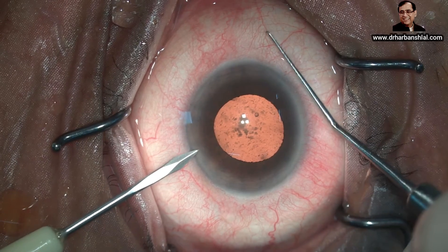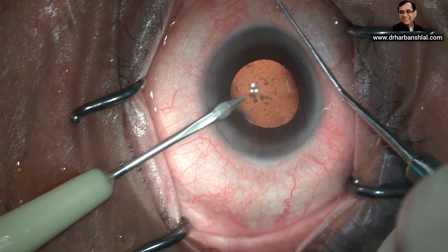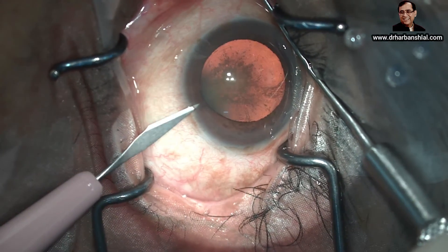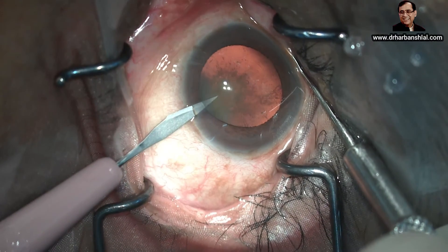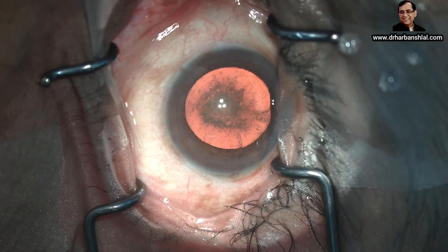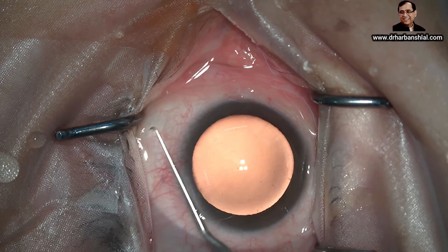We are making it about 0.75 millimeters more central than where we usually make the incision. You can also use the 15-degree blade for making this incision, but you should not put the blade completely inside the eye because the incision will become too leaky. Remember that this blade cuts only on one side, not on both sides.